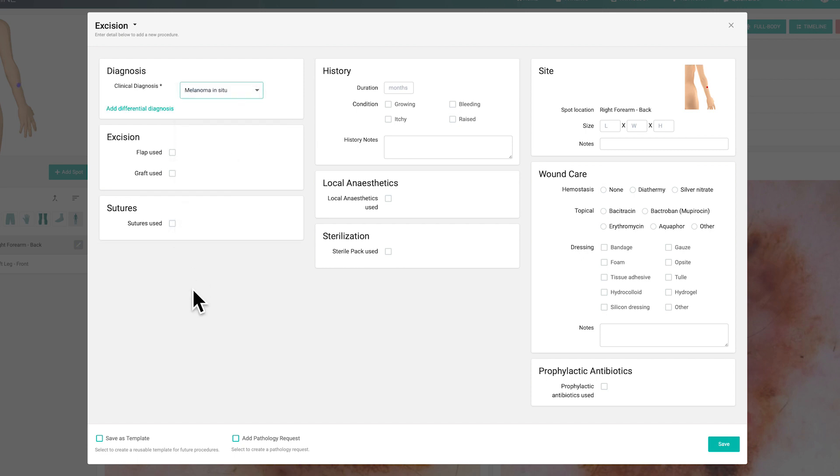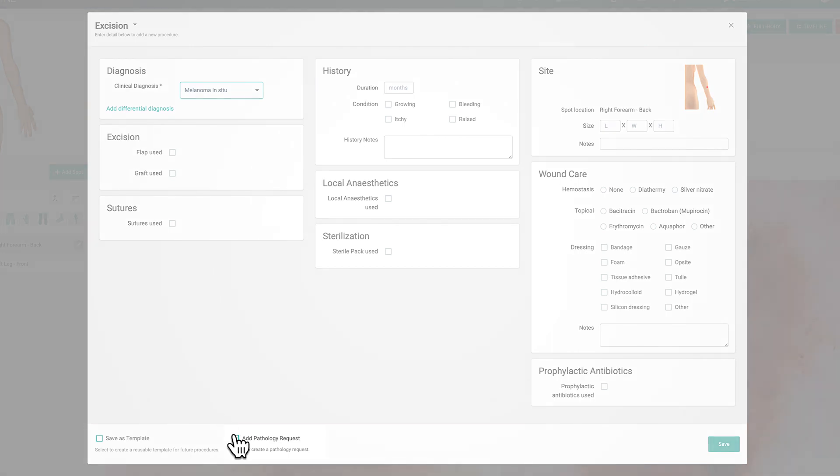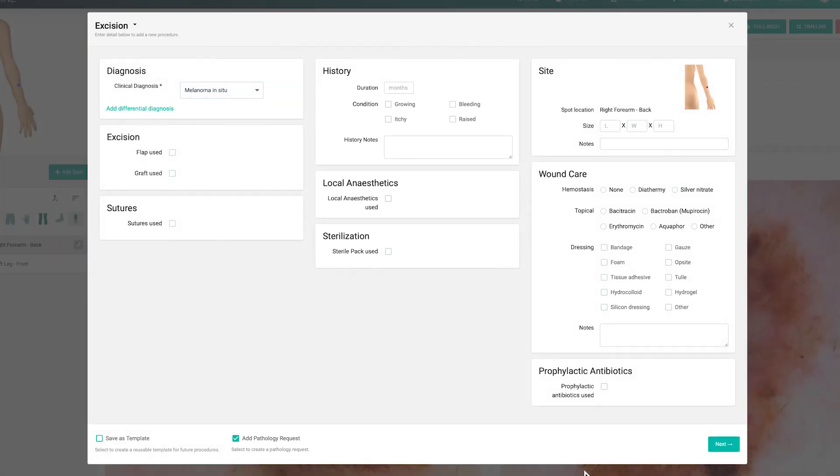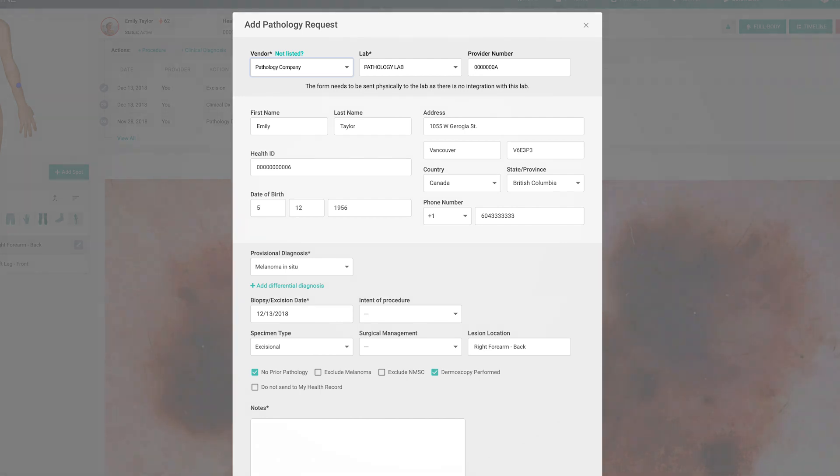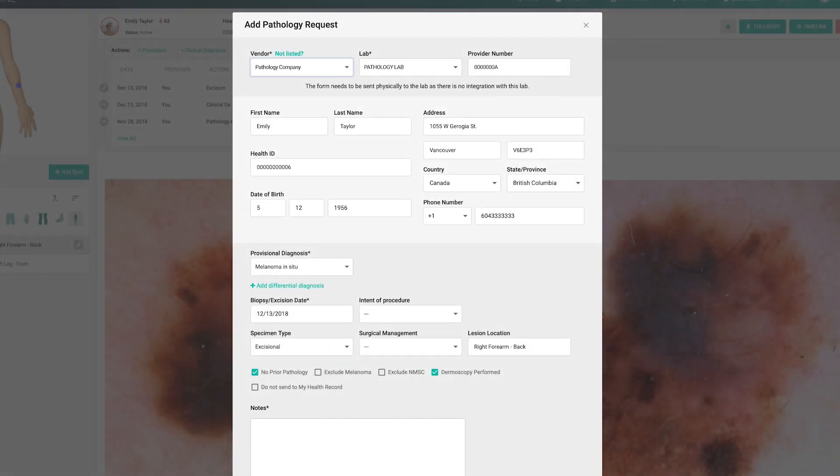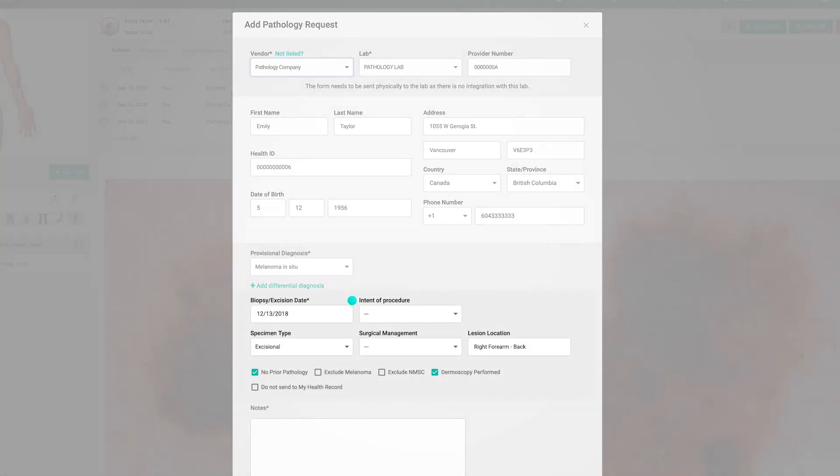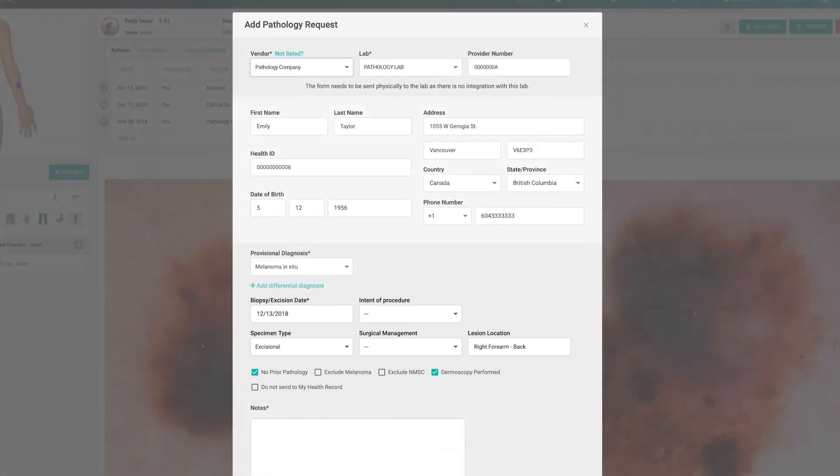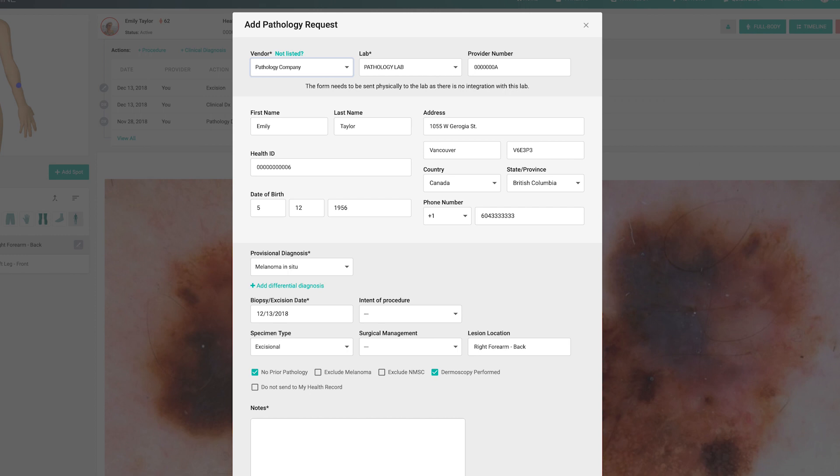If you select add pathology request, it will take you directly to the pathology request form. Simply select your vendor, lab, diagnosis, and add your notes. You also have the option of filling out the fields like the intent of procedure, specimen type, and surgical management. If you are integrated with your pathology lab, this request and all associated images will be sent directly to the lab. Alternatively, you can print this form out to send along with your specimen.